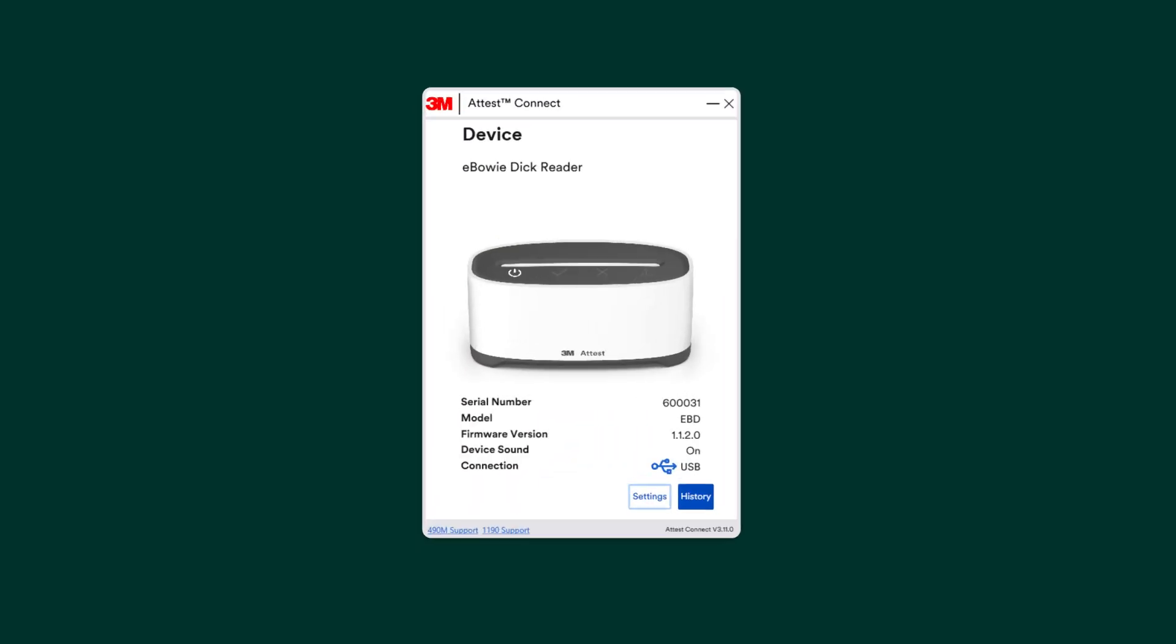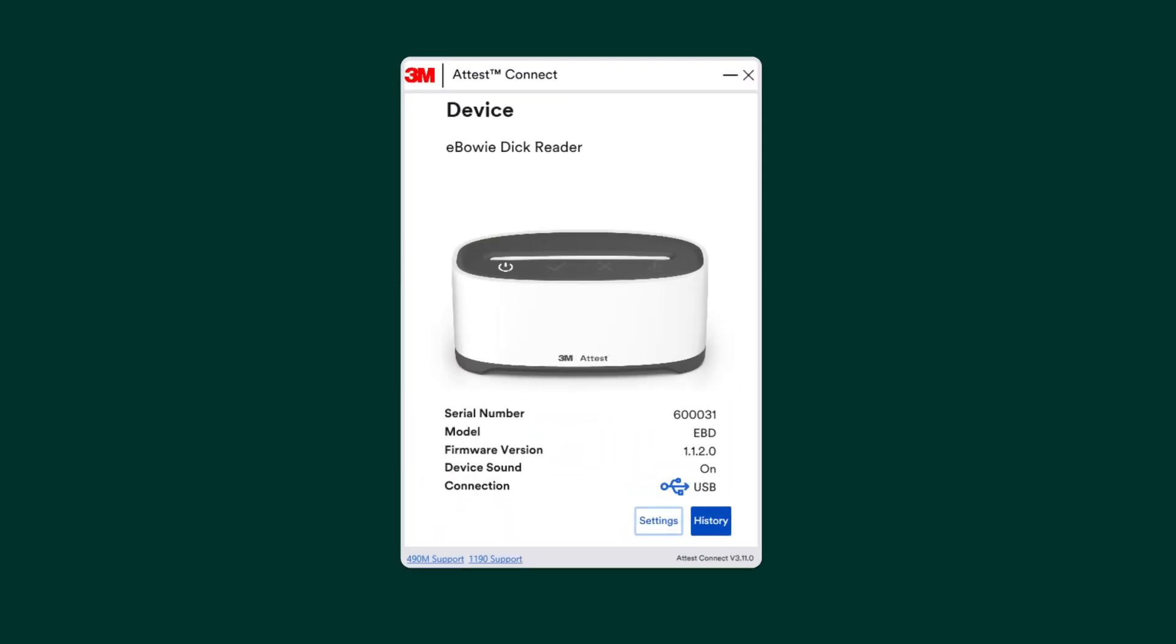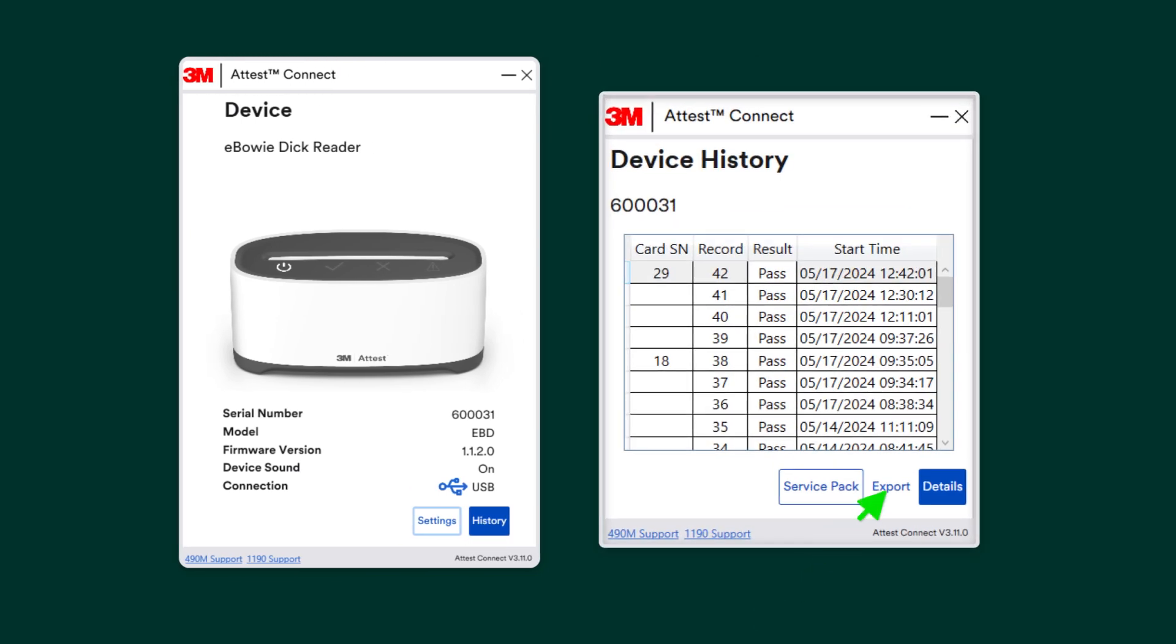To export your test results, first click on the History button. In the Device History window, click on the Export button. You can then save the results to your computer to store for your records or print.